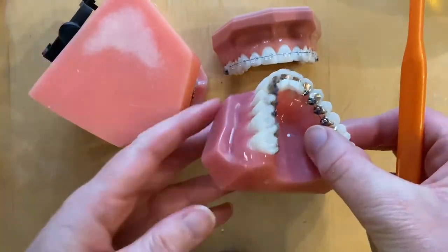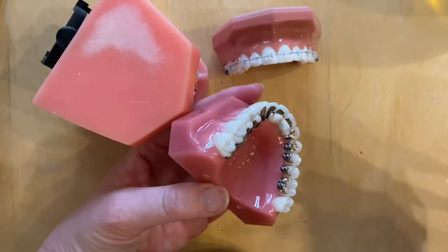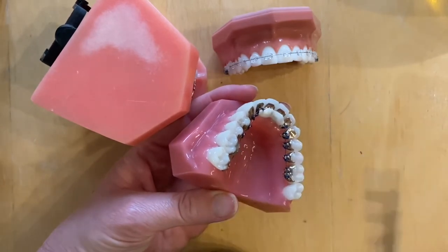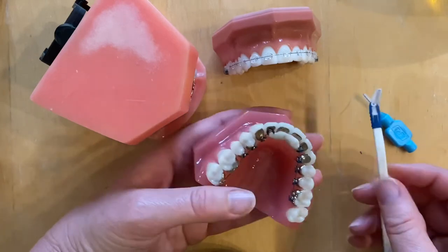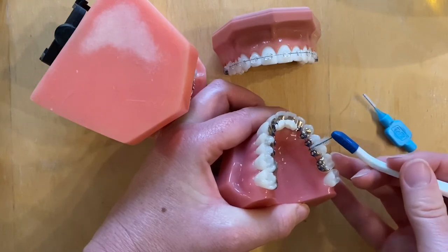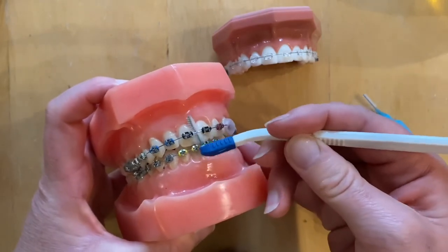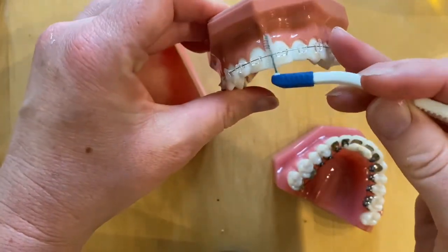For lingual braces the technique is the same, but it's more difficult to reach the gum. A toothbrush with slightly longer bristles, a small head, or a single-tuft brush works well for massaging around the edge of the gums underneath the hooks. It's also a good idea to use a small dental brush or one on a stick to go underneath the wire between the brackets - for lingual braces, go in between each bracket underneath the wire to clean the edge of the bracket and the tooth surface. Do the same with ceramic brackets to keep them as clean as possible.